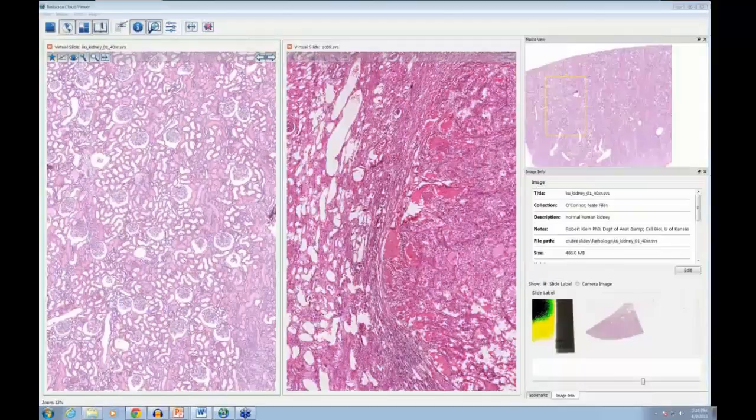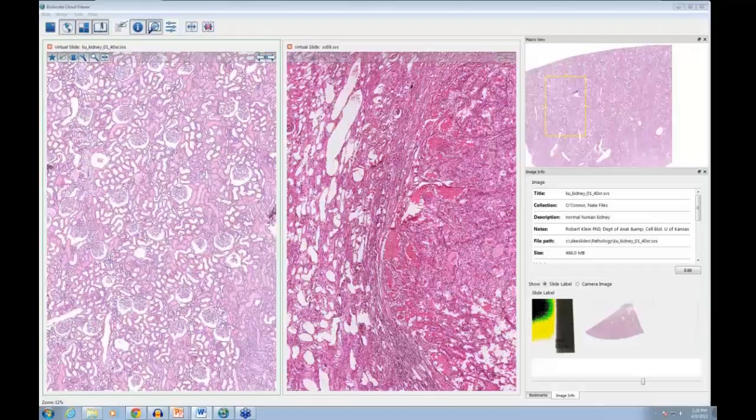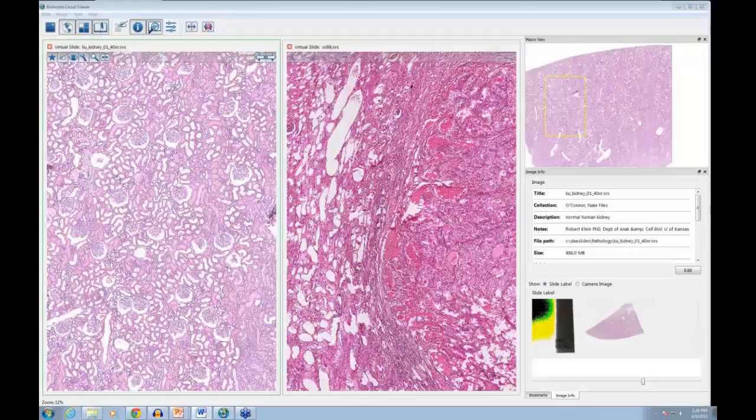Regarding specimens from different scanners: Biolucida handles many image formats, including standard formats like TIFF and JPEG, and various confocal unit formats for supplemental research data. For virtual slides, we support proprietary scanner formats from Zeiss, Olympus, Hamamatsu, and Aperio — notably SVS files — as well as as many other scanner formats as possible.